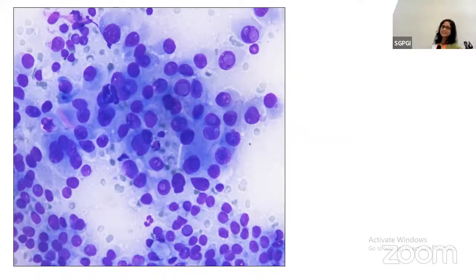That will help you. So a very cellular aspect, what we are seeing are mainly oncocytic cells. As per the new WHO, we have stopped calling anything Hurthle, as sir described yesterday, and we call them oncocytic cells. So predominantly oncocyte-rich aspirates. The nuclei were predominantly large, enlarged, and round. And you can see multiple intranuclear inclusions.